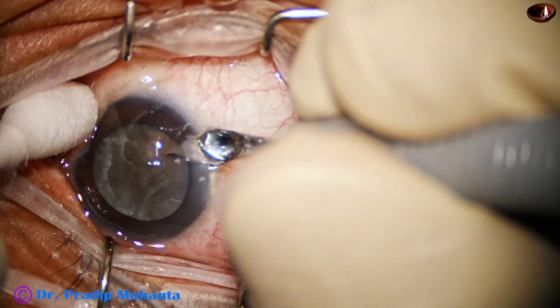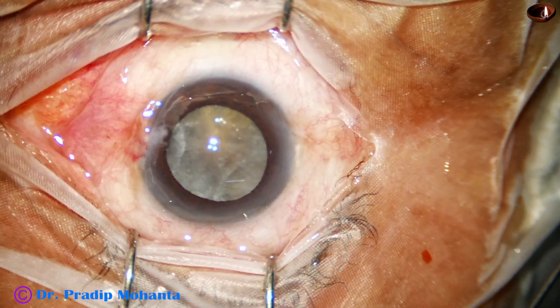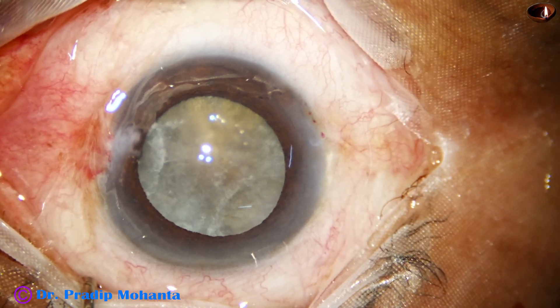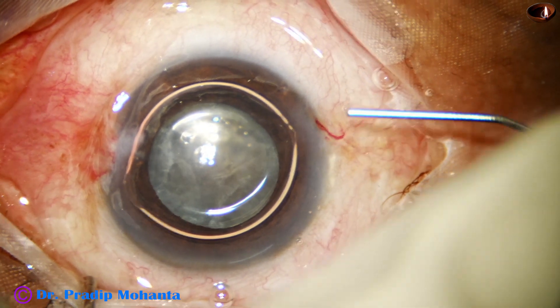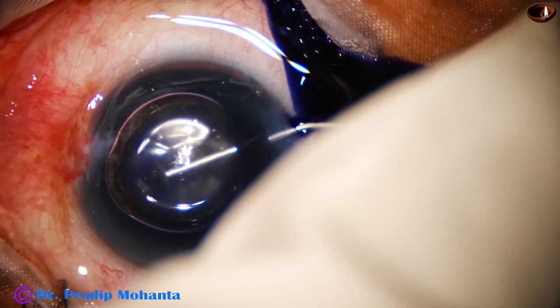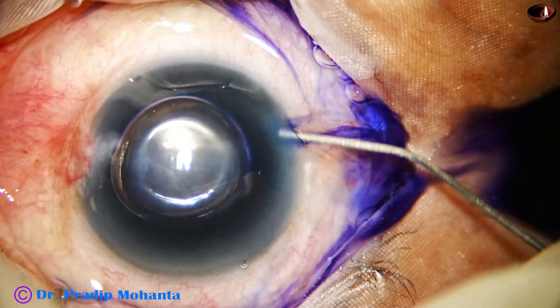First I do the side port and use trypan blue dye to stain the anterior capsule. I always use an air bubble, and beneath this air bubble the trypan blue dye is injected. The dye settles on the anterior capsule immediately and the staining is very quick.